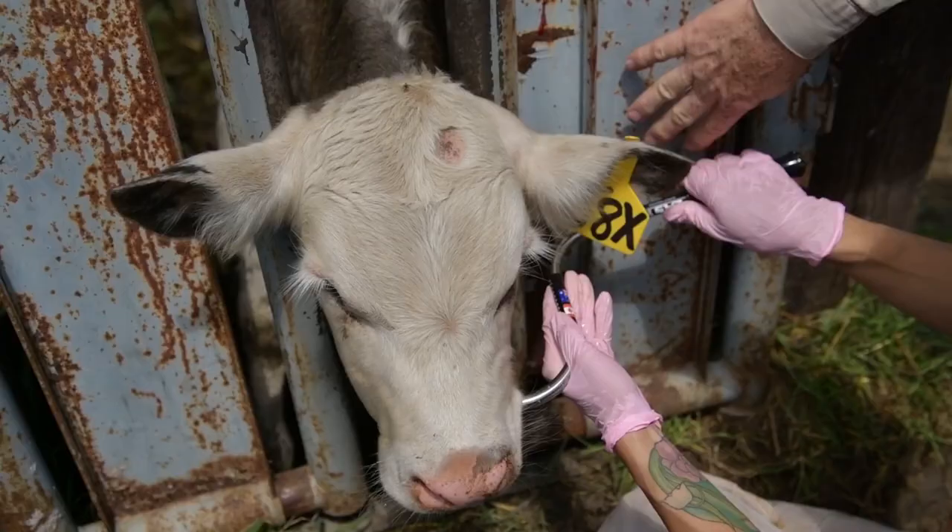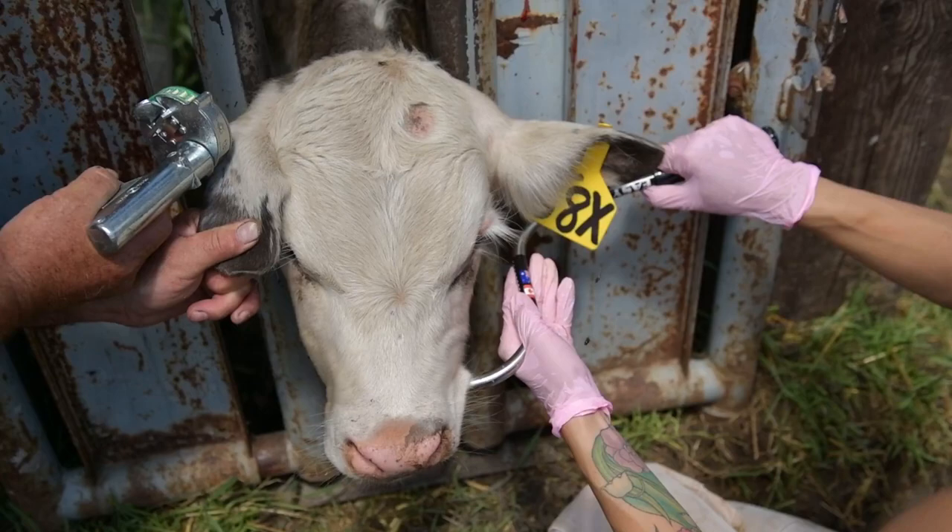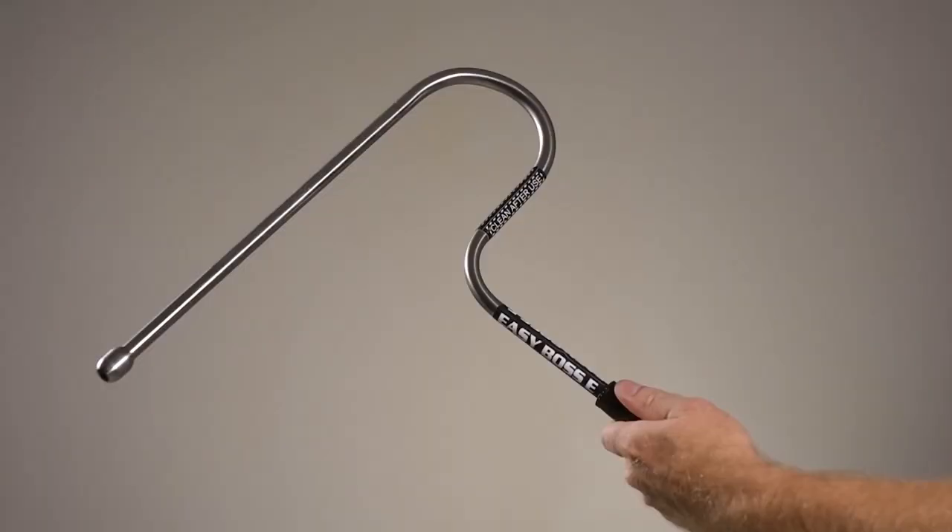We have used it for ear tagging animals — mature bulls — and in one instance we had 25 mature bulls that we were re-ear tagging, and it immensely improved our success and lack of duress on the animals with the use of this device.